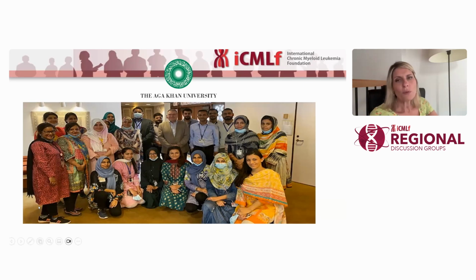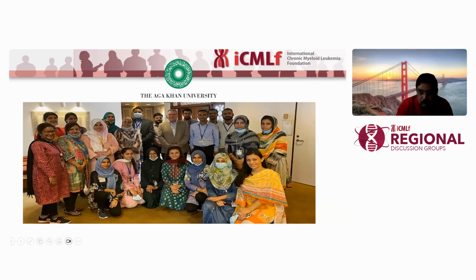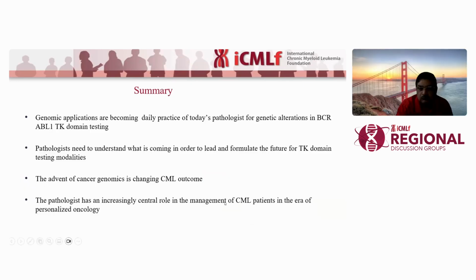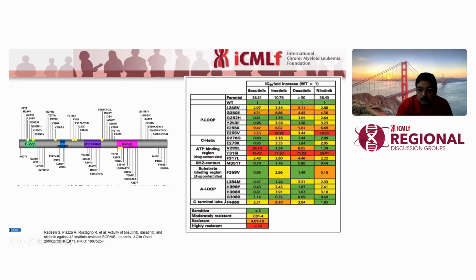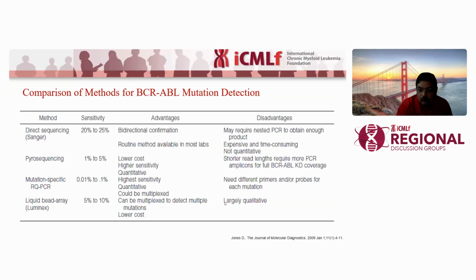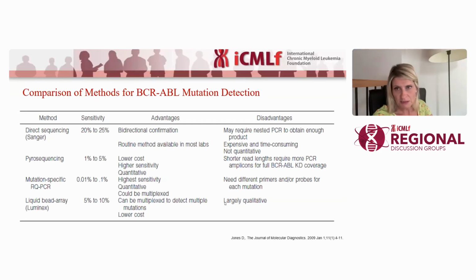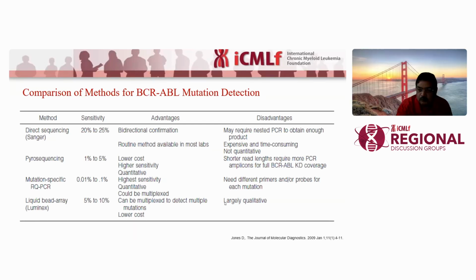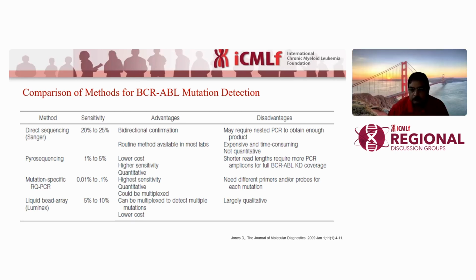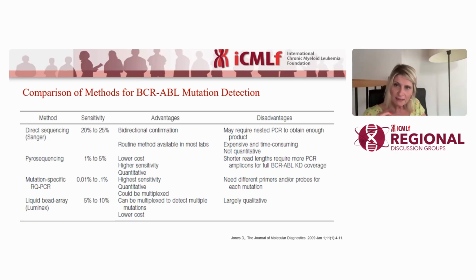Yeah, I just wanted to point out, regarding the table reporting the different technologies, that actually none of them is really suitable for routine testing. So again, we come back to Sanger sequencing as the easiest and quickest way to perform testing. I also wanted to comment on the type of mutations and the traffic light table.